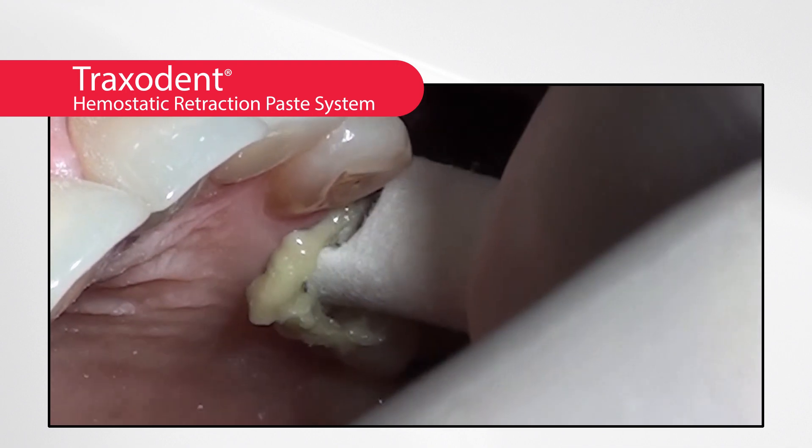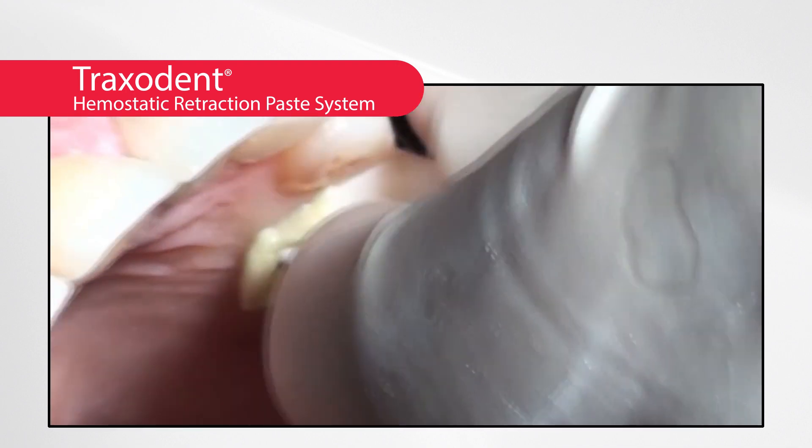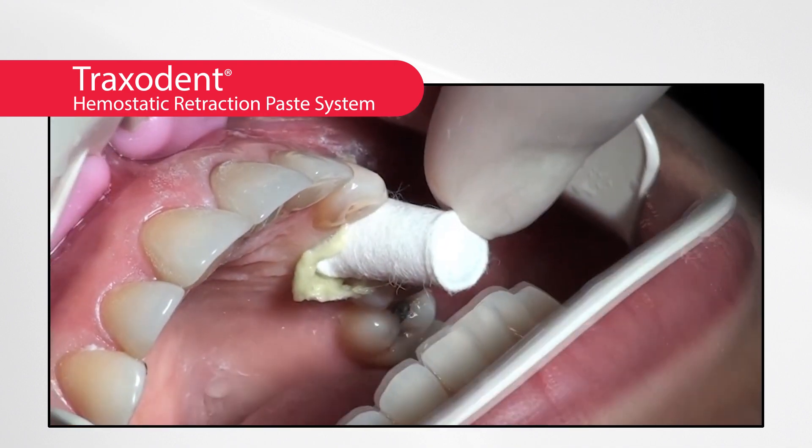Next, select the right size retraction cap — small, medium, or large — and have the patient bite down to apply direct pressure to the sulcus.